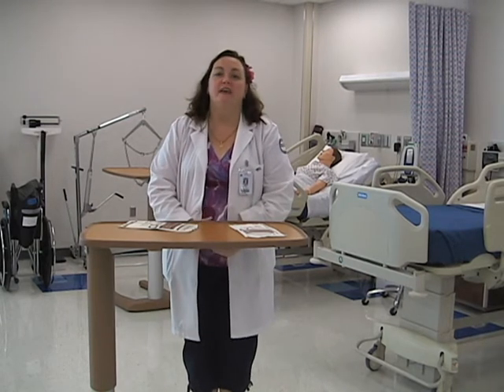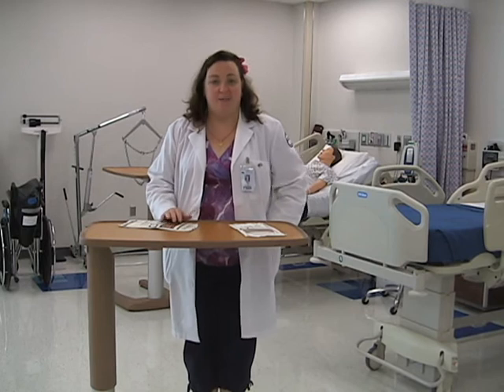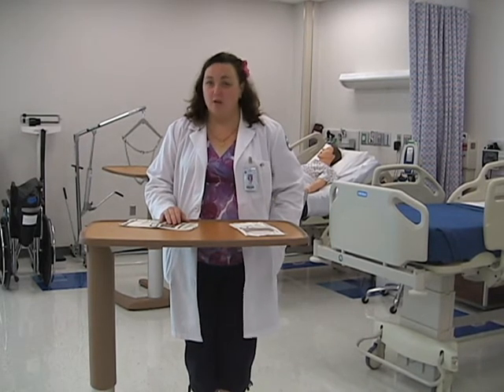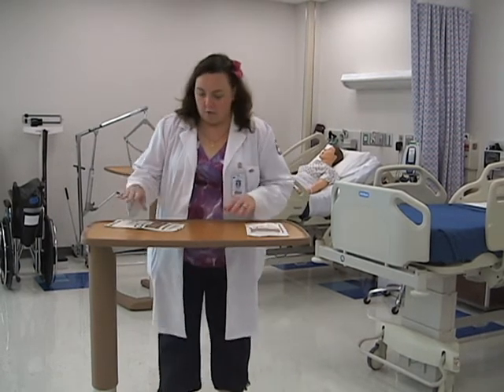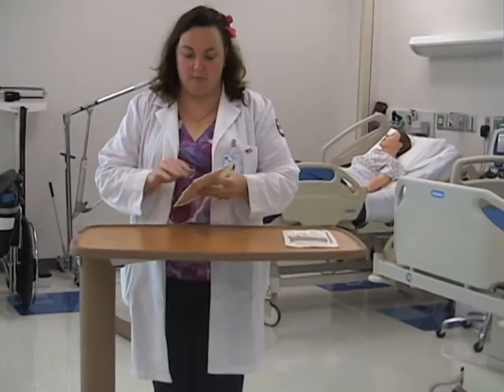The other thing you've got to make sure is that you have gloves that are appropriate for yourself and for your patient. For example, if you have latex sensitivity or you have a patient who has a latex allergy, make sure these are not latex sterile gloves. When you go to open up your package, make sure you have the correct size. Because I'm a medium-large, I'm going to use size 8. Gloves will actually go up to size 9 and a half, and they're huge.